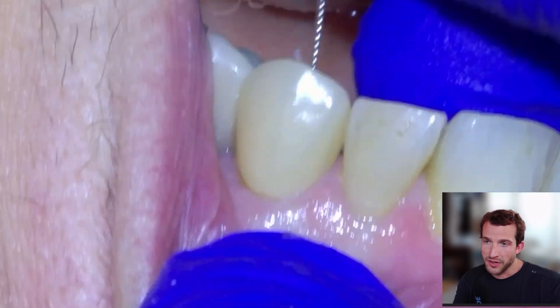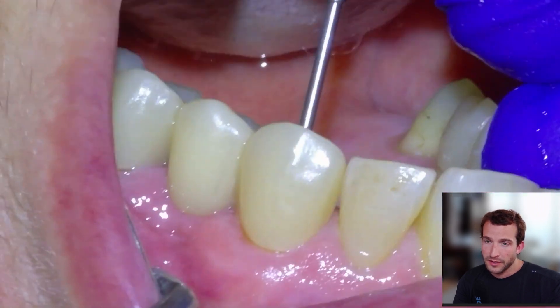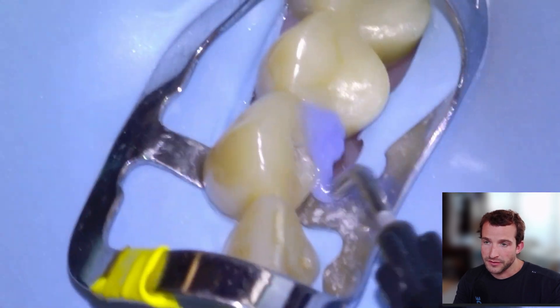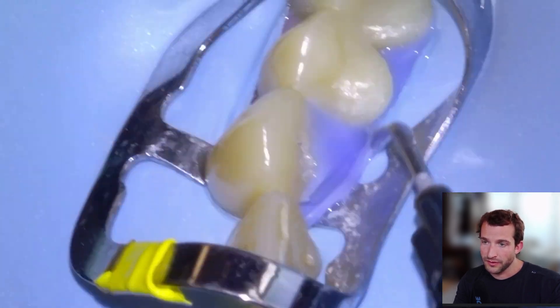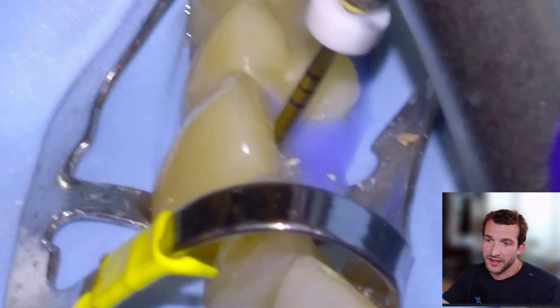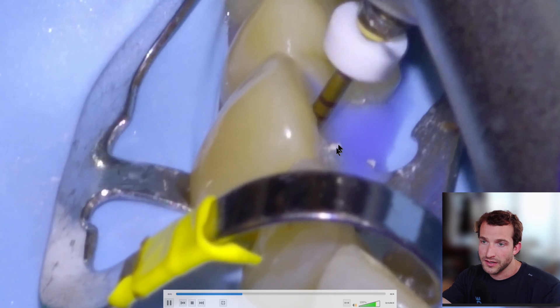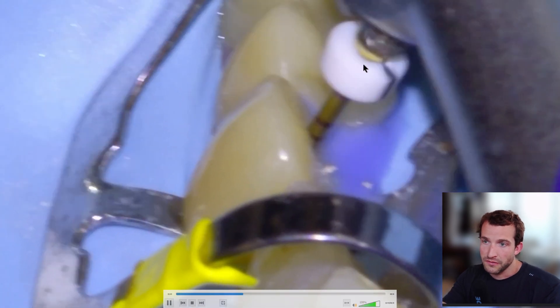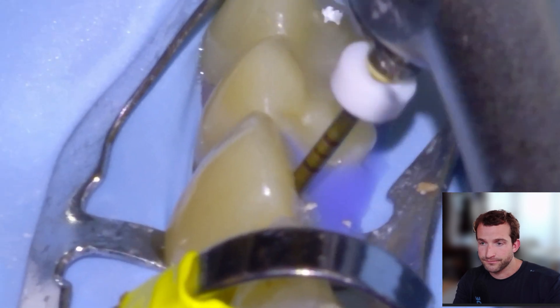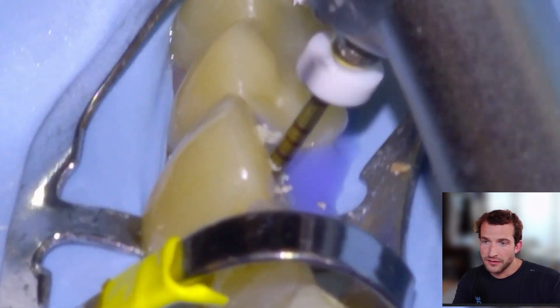We'll typically use 31 millimeter files, just working around until we can feel it drop, then open up the area where we felt the file drop so we get a more predictable access. We're going to put a rubber dam on with liquid dam to cover up the deficiencies, and then just begin getting our 1504 file down to length with some RC prep. Pretty routine endo here.